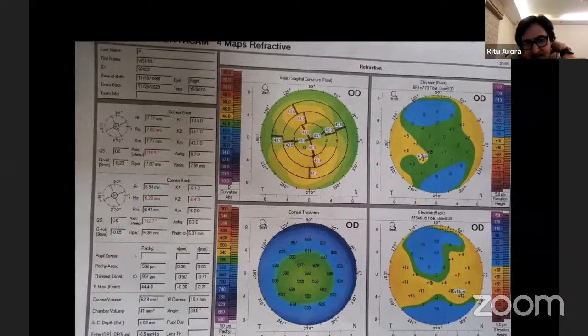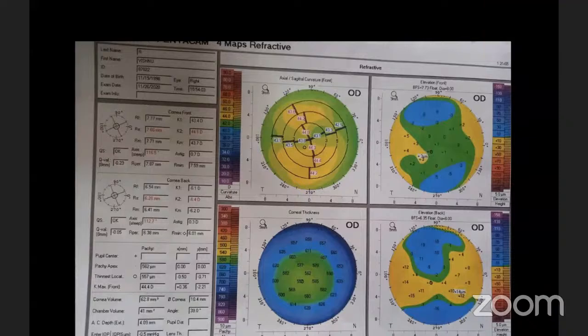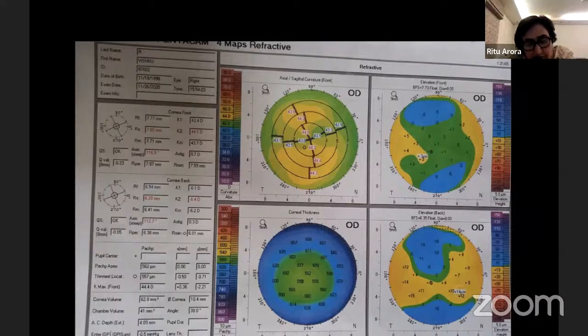You see a small circle in the 7 o'clock area, within the 3 mm circle. Are you seeing? Yes, ma'am, the small round one. It basically shows the fixation of the patient. No, you mean the patient is fixating downwards?